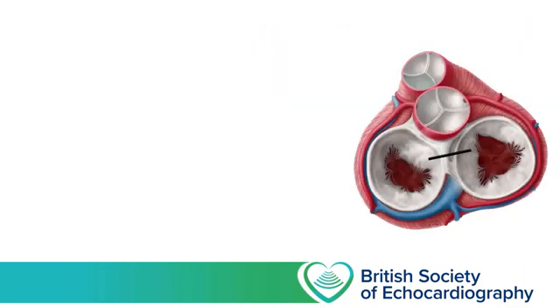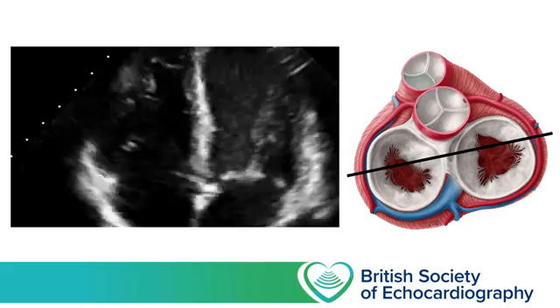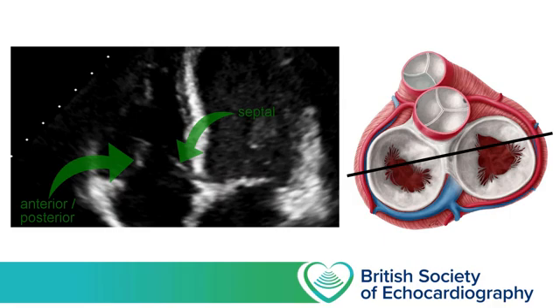Whilst the tricuspid valve is visible in both the parasternal short axis and subcostal windows, it's in the apical four-chamber view that we pay the most attention to it. Just as with the aortic valve in the parasternal long axis view, it's not always possible to know which of the tricuspid leaflets is visible. In the apical four-chamber view it will be the septal leaflet, adjacent to the intraventricular septum, but the leaflet arising from the free wall could conceivably be either the anterior or posterior leaflet, depending on how the probe is angled.